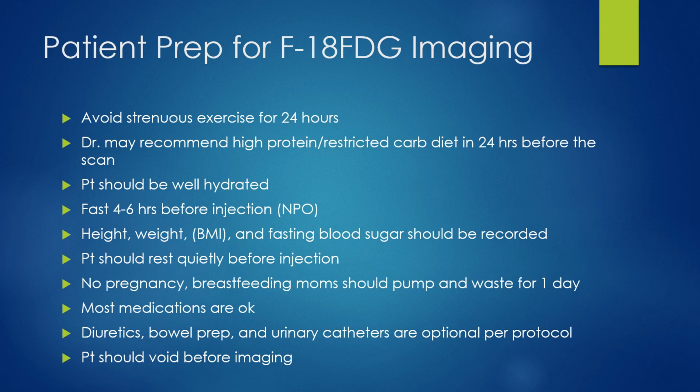And some facilities will actually test for pregnancy. Other ones just have a form for the mom to sign. Most other medications are okay to take, and diuretics, bowel prep, and urinary catheters are all optional parts of the protocol. We do want the patient to have an empty bladder before we start.